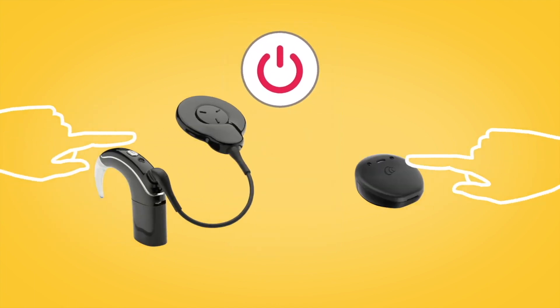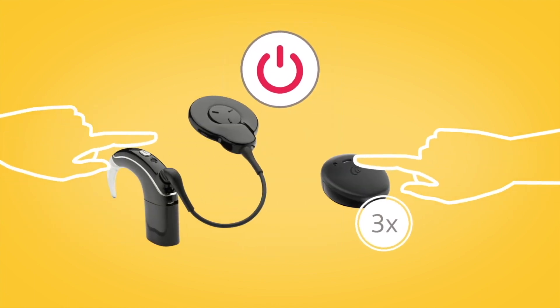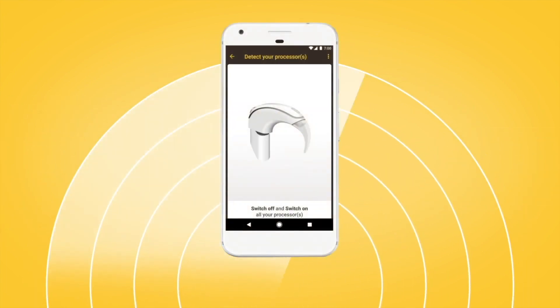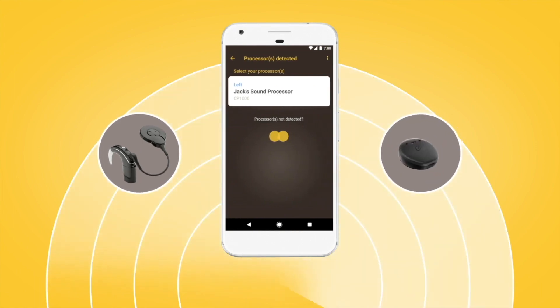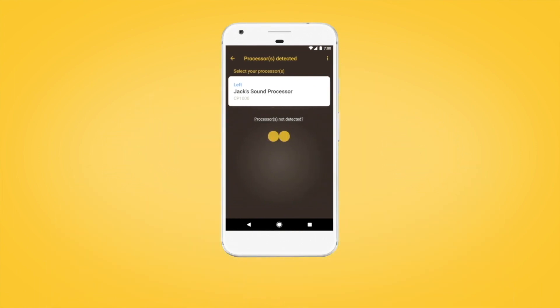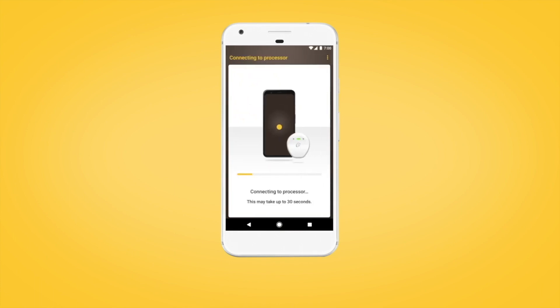Next, turn your sound processor off and back on again. Your Android device will then search for your sound processor and display it on your screen. When your sound processor is displayed, select it to begin pairing. The pairing process may take up to 30 seconds.